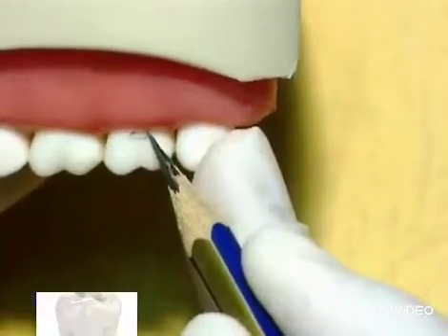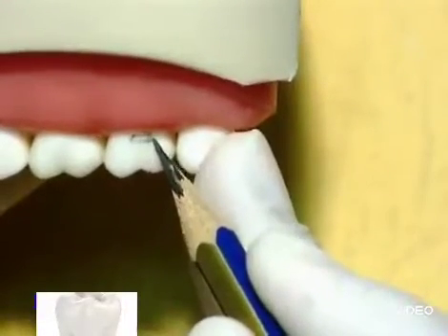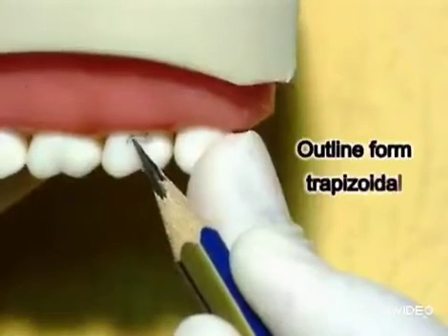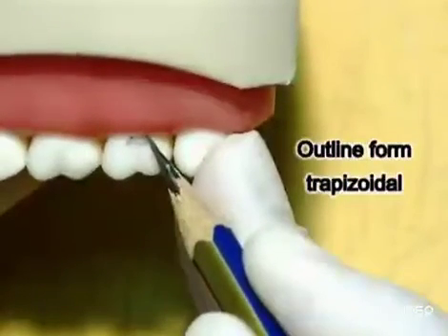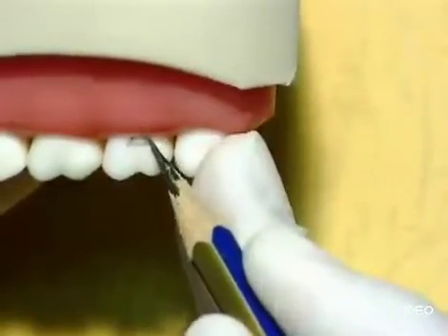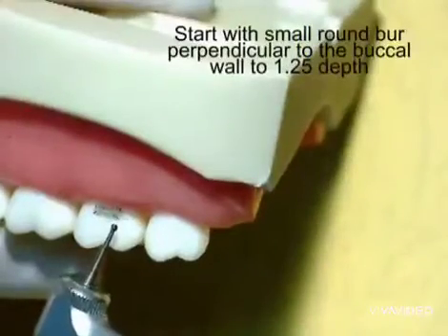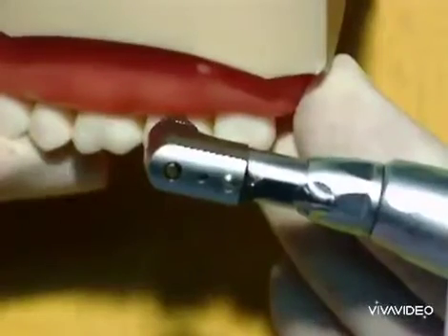This is a demonstration of Class 5 amalgam cavity preparation. We can draw the outline form using a sharp pencil. Usually, the caries affects the cervical surface of the tooth.